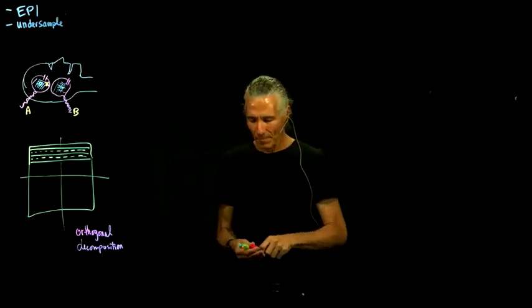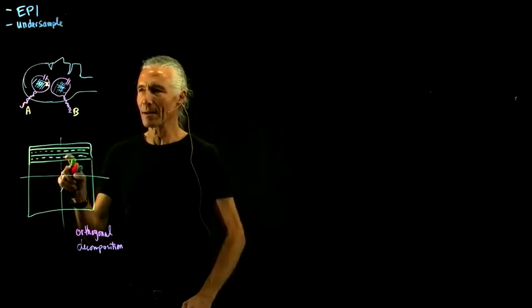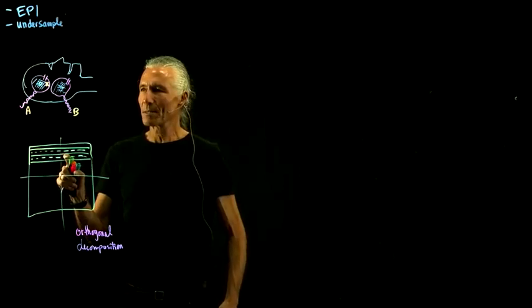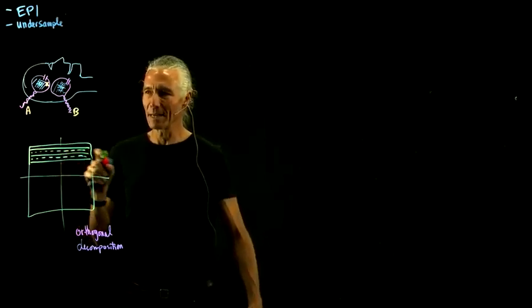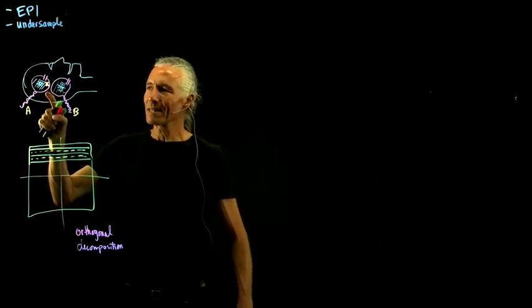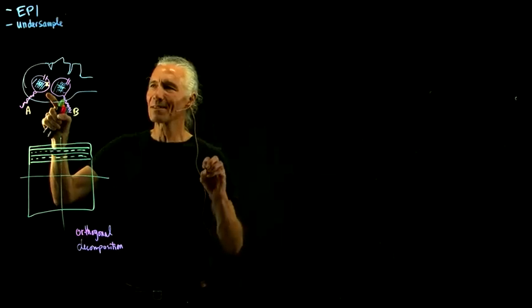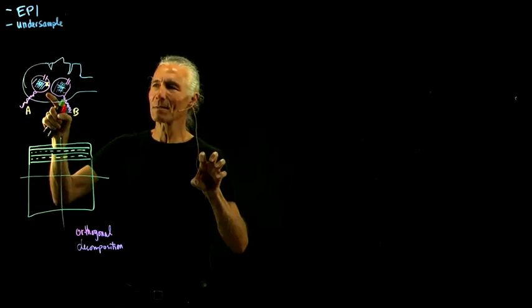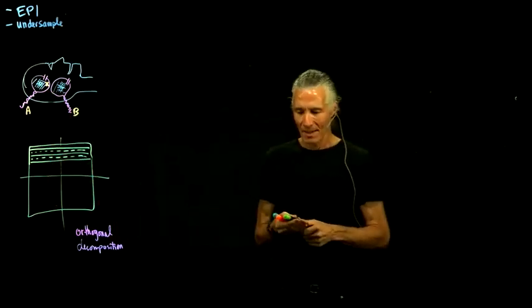So when you first hear this, how could we possibly interpolate here? Because we don't know what to really interpolate, because it's completely independent information in each line. And so that's what this does. When you have coils like this, it allows you to essentially smear the spatial frequency data out into different frequencies. Very, very counterintuitive, but here's how it works.